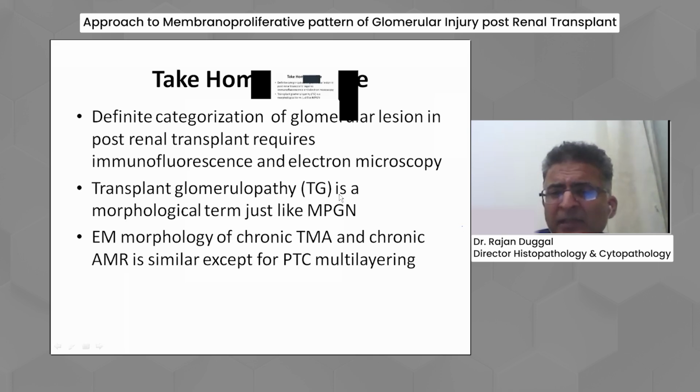With which is TMA most commonly encountered with CNI toxicity? Acute, subacute, or chronic? Can acute CNI toxicity also cause acute TMA? Absolutely. I must tell you, if I see TMA early post transplant, I'm talking about an ABO compatible setting, in the first 1 month of transplant, majority of the times it is CNI induced. And what kind of TMA will I get?